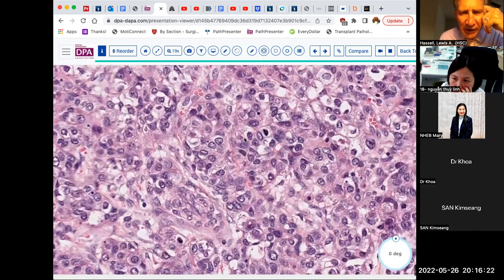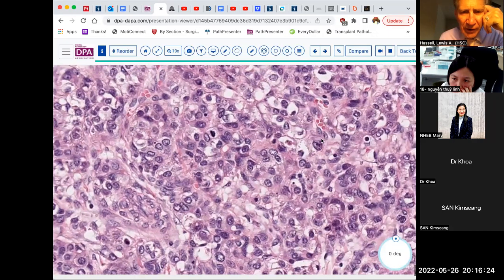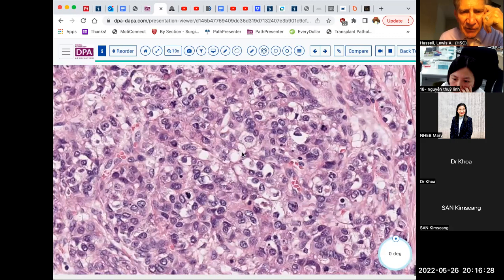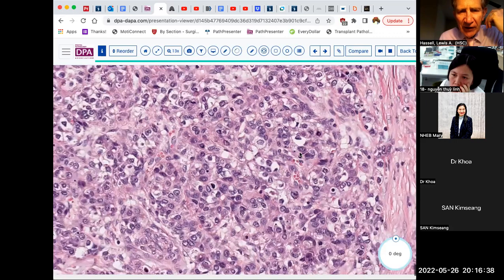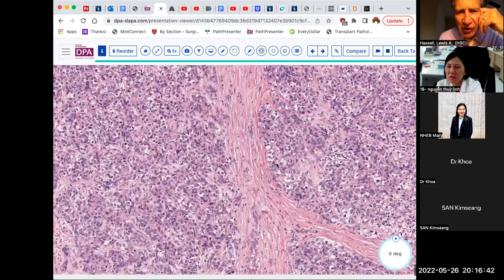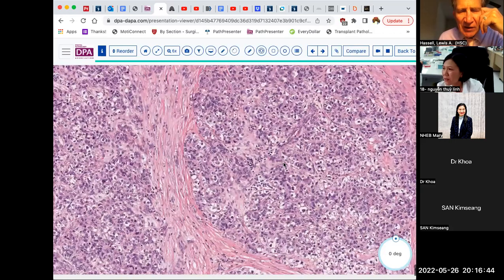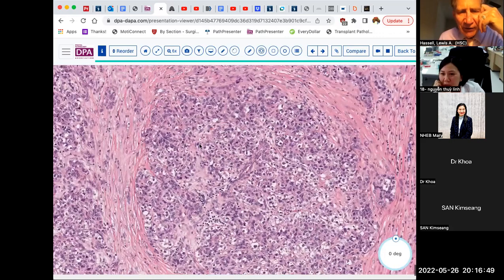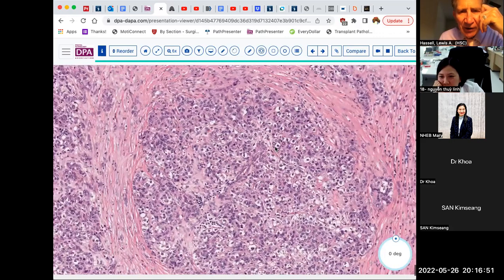And so that's another clue that you may be dealing with a combined tumor, if you see this intercellular variation with a dual morphology that's all mixed up. It's like they took the hepatocellular component and the cholangio component, mixed them all up in one bag and then poured it out so that it's forming a single mass.